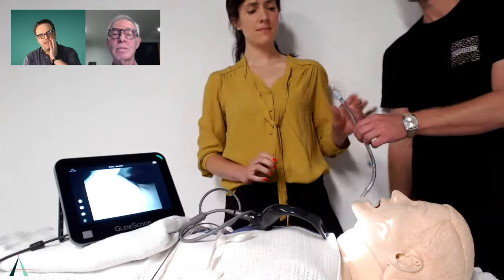The other thing I will say, Curtis, and this applies to an elective setting too, and we've sort of skipped this because I don't have enough hands to inflate cuffs and things, but one of the things I've found really useful about using the hyperangulated blade is that I leave the blade in once I've placed the tube if I'm not doing a rapid sequence intubation, and I actually watch while I inflate the cuff to make sure it's not herniating above the cords or that it hasn't moved since I put it in. And I found that really useful, to be able to visualize the tube and be a lot more deliberate about tube positioning than you potentially are with a direct laryngoscope.